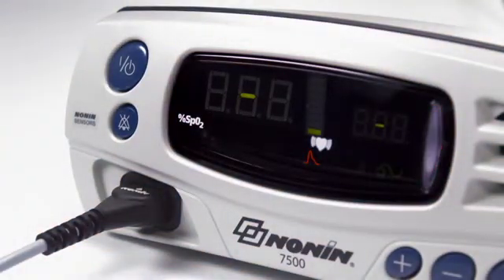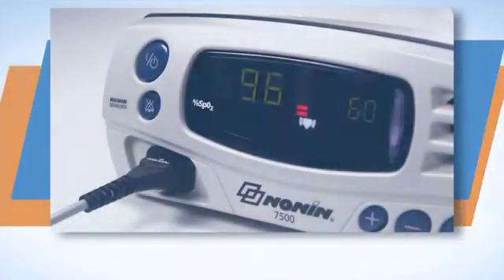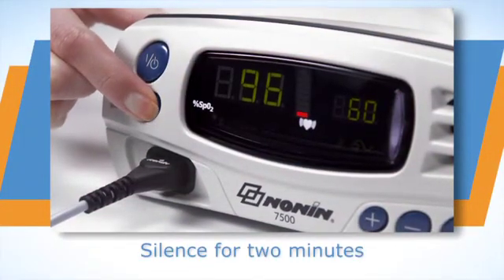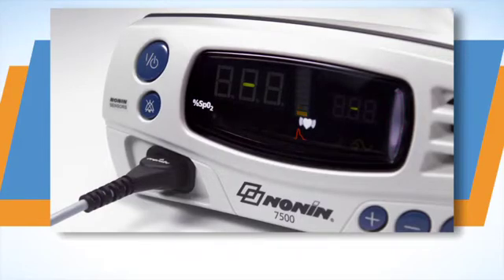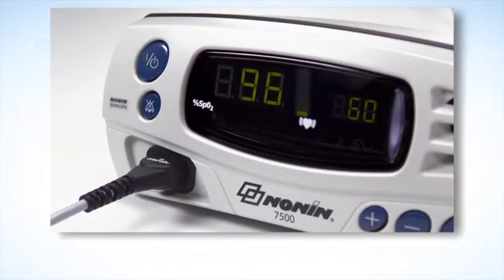For medium priority alarms, more often generated by an oximeter or sensor signal condition, the LED will blink amber slowly and 3 beeps will repeat every 25 seconds. You can silence the audible alarm for 2 minutes by momentarily pressing the alarm silence button, and you can return the audible alarm by momentarily pressing the alarm silence button again. When oxygen level or pulse rate return to the preset range, the alarm will stop and return to normal monitoring function.